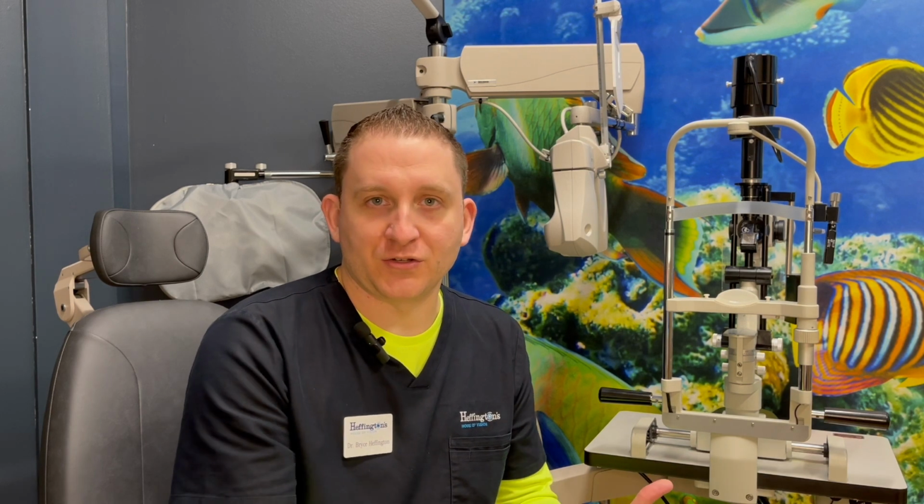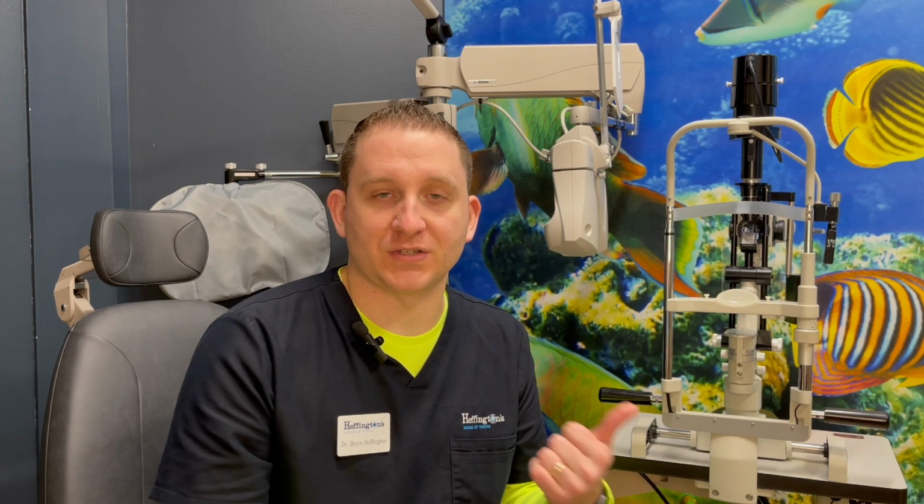So we use the fundus camera or the fundus photography instruments to monitor conditions in the back of the eyeball and observe how they change over time, whether we're watching somebody with glaucoma, macular degeneration, diabetic retinopathy, retinal detachments, holes, tears, you name it. The cameras help us to document and track what's going on. So in a few moments, you're actually going to see what the back of my eyes look like.